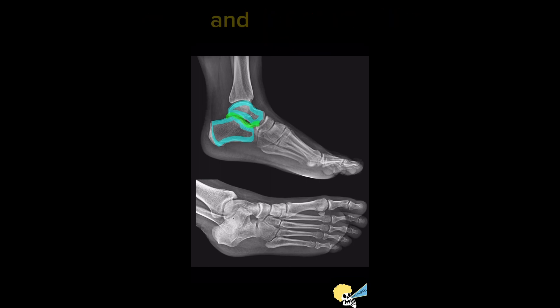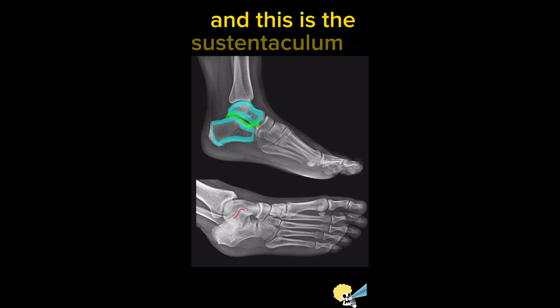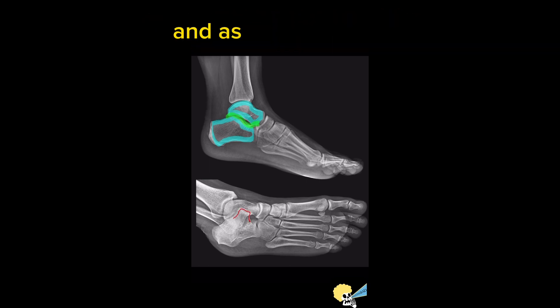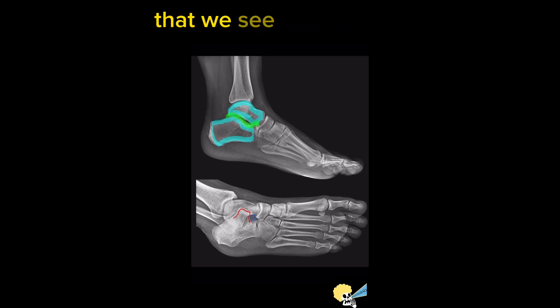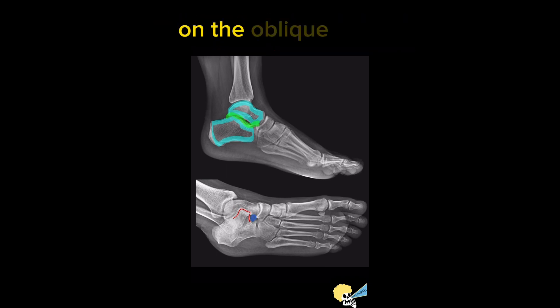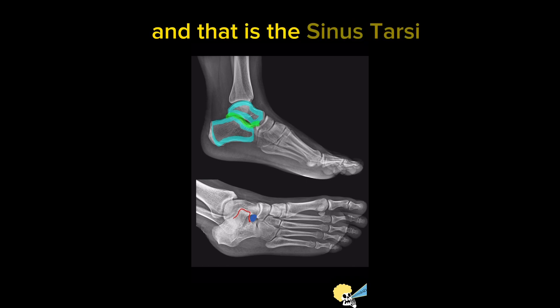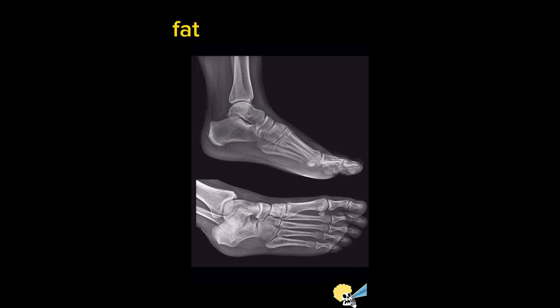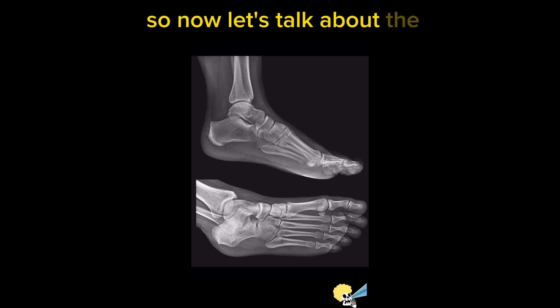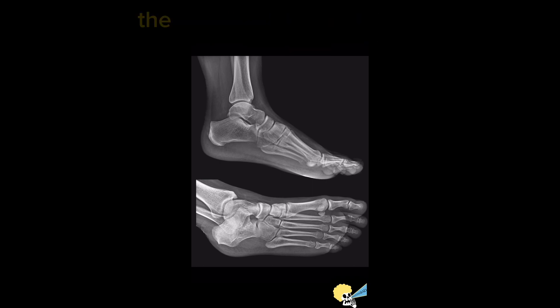Of interest, the calcaneus has a bump at the medial aspect of the body called the sustentaculum tali, and as the name notes, it sustains the talus. There is a small hole visible between the talus and the calcaneus on the oblique view, and that is the sinus tarsi, which is usually composed of fat and nerve endings.